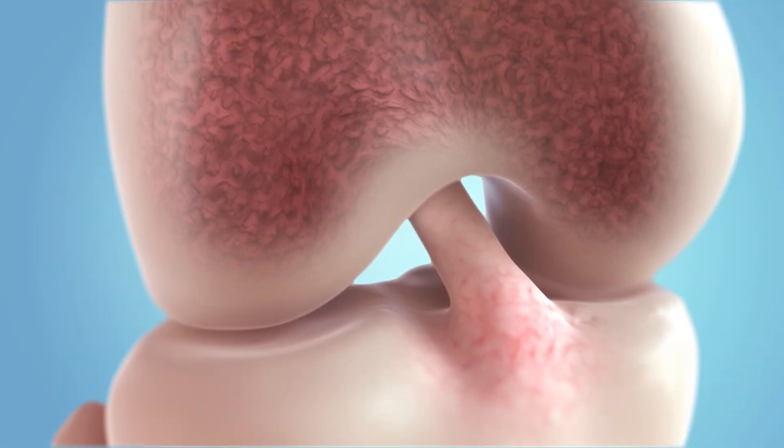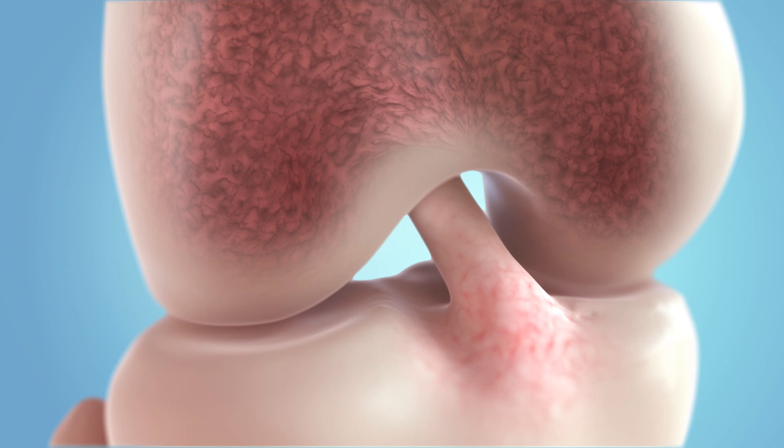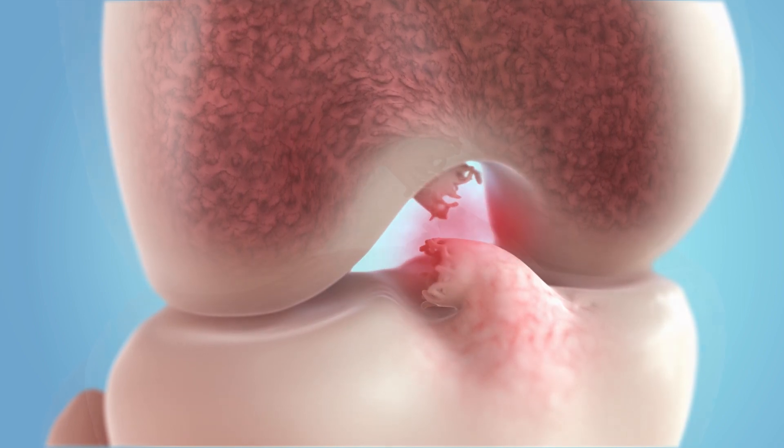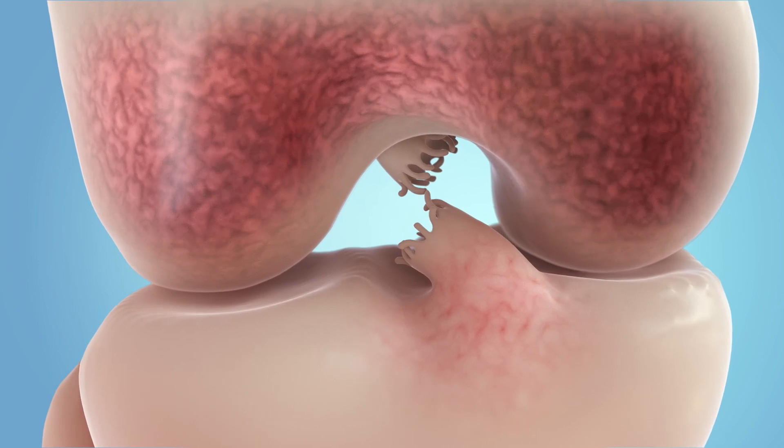Bridge-enhanced ACL restoration is a game-changing new procedure that stimulates a torn ACL to heal itself, eliminating the need for a tendon graft.